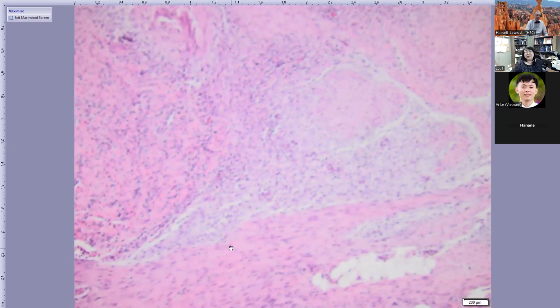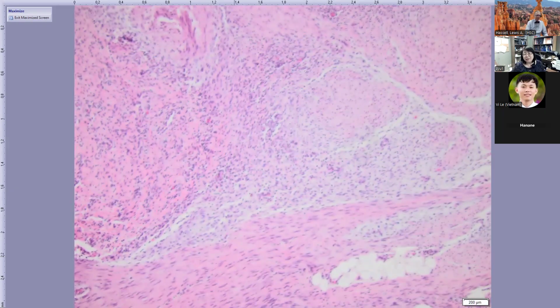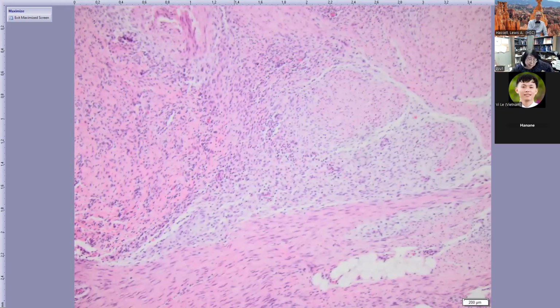In an 11-month-old infant, a boy, in the axillary soft tissue, what is the differential? Anyone want to give a diagnosis? The clinical presentation is classic. Usually it's a boy, usually it's axillary. It can also happen in other locations, and can happen in girls. And the histology is the triphasic organoid arrangement. It's uncommon, but the name is fibrous hamartoma of infancy.